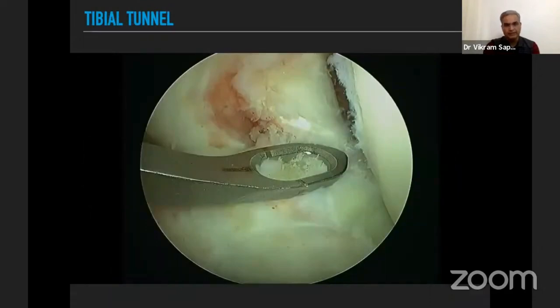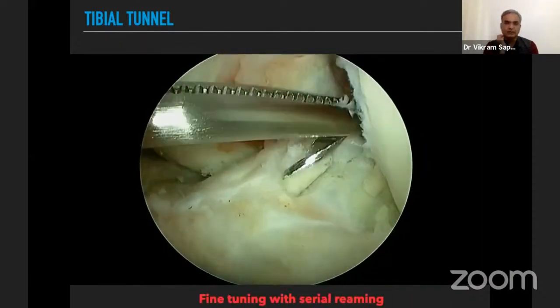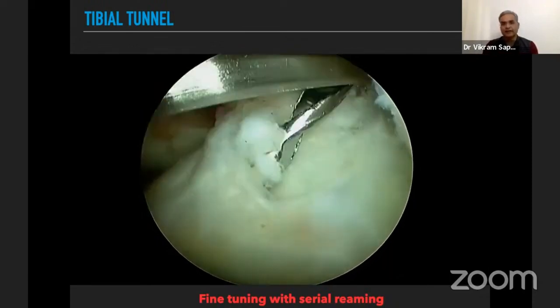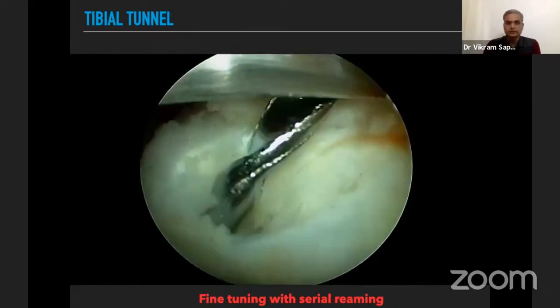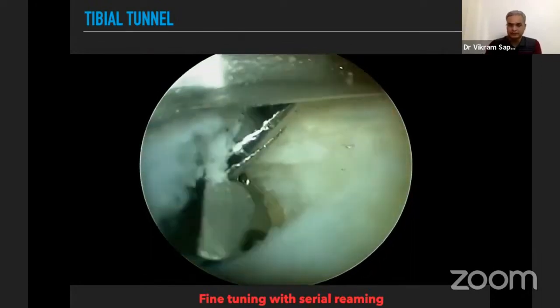For the tibial tunnel, I also prefer targeting the center of the tibial footprint and commonly use a footprint jig for this. I prefer fine-tuning with serial reaming — first passing a guide wire and using the smallest 4.5 mm reamer, then serially reaming to fine-tune the tunnel position if we need to shift medially or anteriorly.